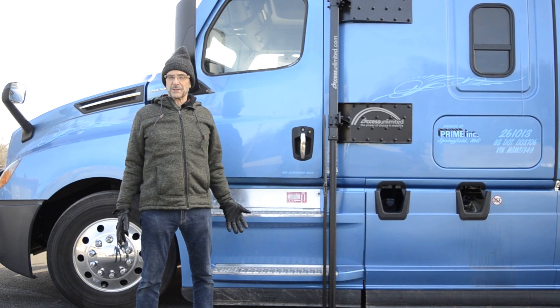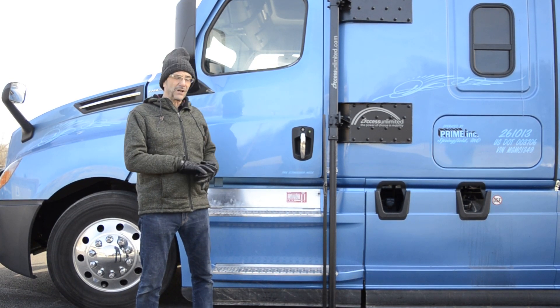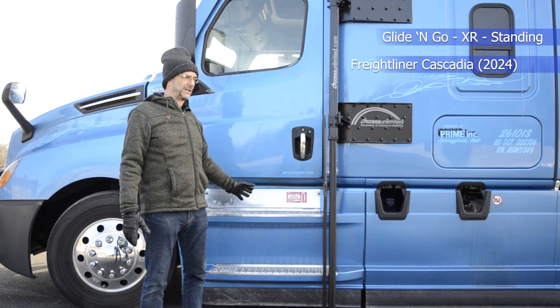Hi and thanks for tuning in to Access Unlimited's YouTube channel. Today we've got a detailed technical video — a tour of the technical aspects of a Glide & Go XR standing unit. This one is shown mounted on a Freightliner Cascadia, in this case a 2024.